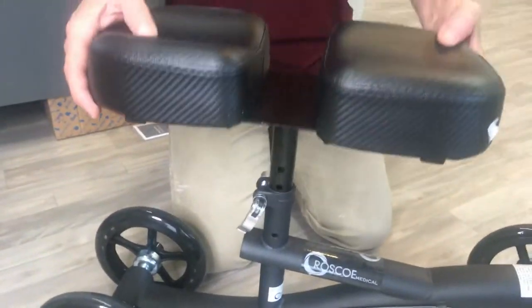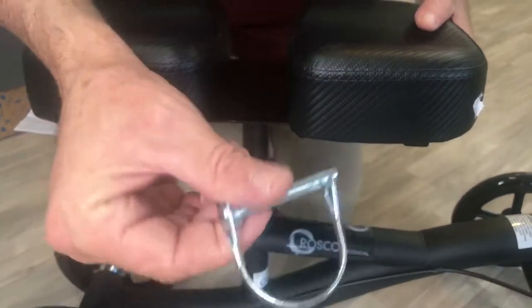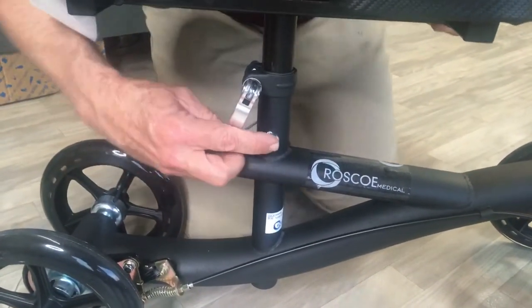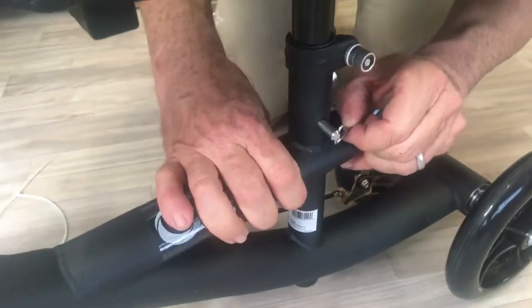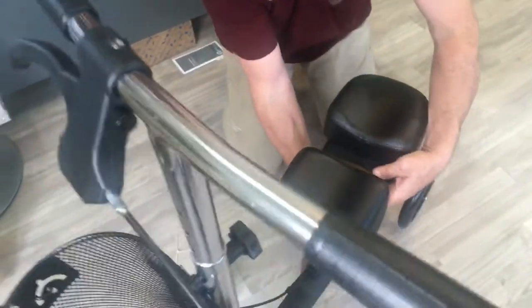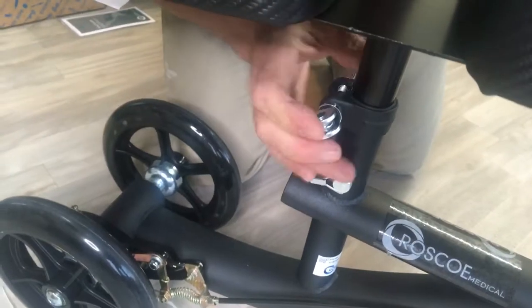We need something to secure the seat in place, and in the hardware package you'll get this little piece. Adjust the height for yourself, then put it through the hole all the way through. On the other side, wrap that clip back around itself so that it's completely secure in place. Then tighten this piece down just like you did the one on the front. Tighten it down — that is secure.